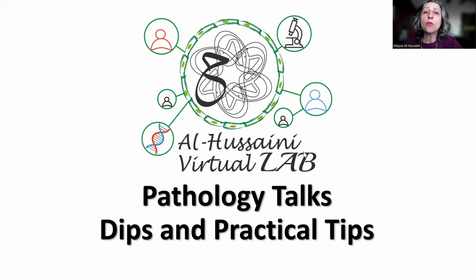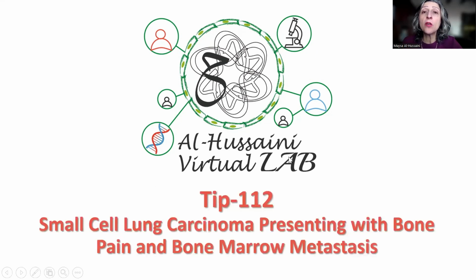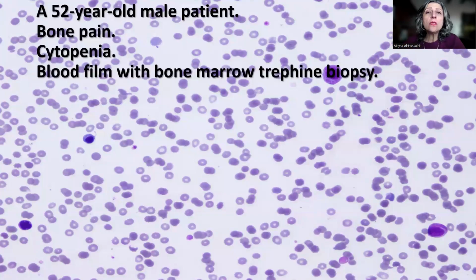What I'm going to be sharing with you today is a nice case of unusual presentation of a small cell lung carcinoma, which presented with bone pain and, on initial presentation, bone marrow metastasis. This is a case of a 52-year-old male patient who started to complain of generalized bone pain of several months duration. He underwent CBC examination and was found to be cytopenic, for which he underwent bone marrow and blood film examination on the assumption that the patient has multiple myeloma.